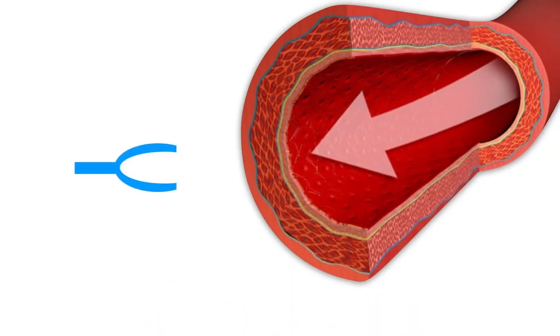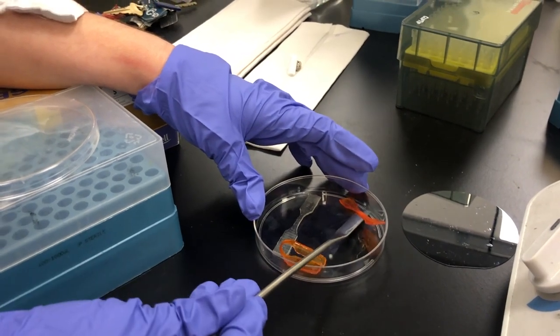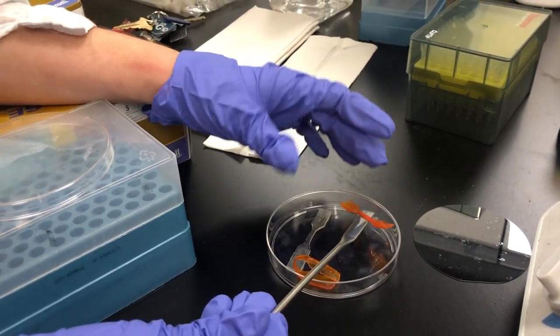And we want to control the final shape of our tiny structures so they can act as the grippers we envision. Here's a shape memory polymer I made today. It's not microscopic, but it'll help us understand what's going on inside.